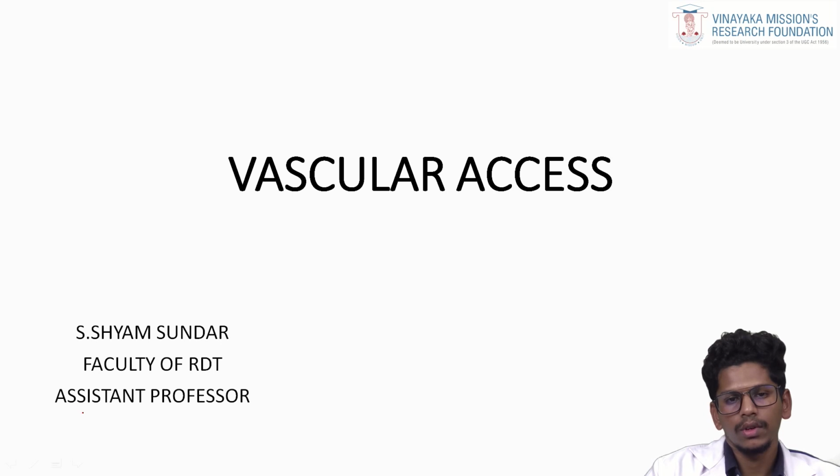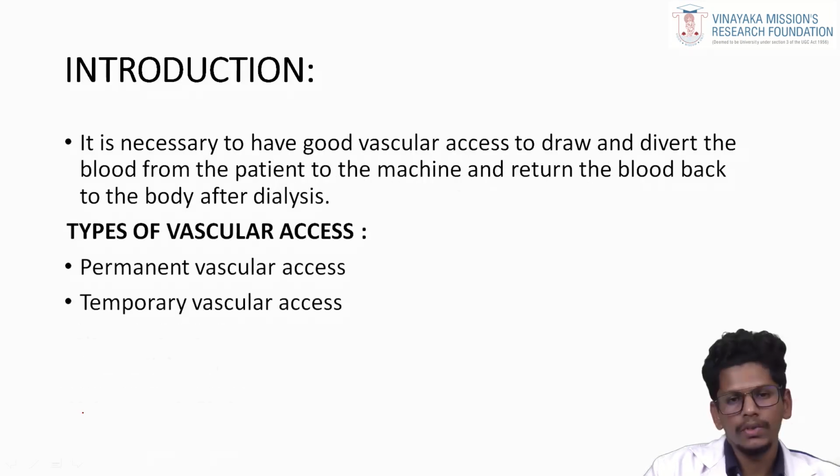Now we are going to discuss the topic of vascular access. Before going into the topic, we have to discuss what vascular access is. Vascular access is the surgical site where blood is taken out from the patient's body, passed through the extracorporeal circuit, and then returned to the patient's body.